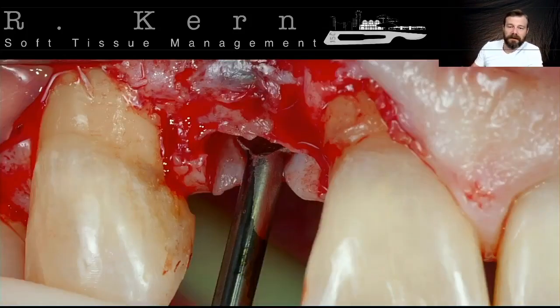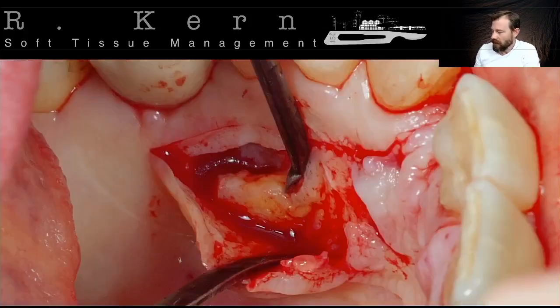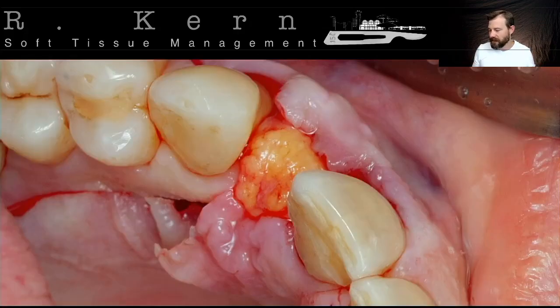And from that point, from the palatal side of that incision that you saw, we're going to detach the pediculum full thickness flap with the periosteum together with the connective tissue. All the thickness that I can bring under the window that I had prepared, right? So here is the full thickness flap. We detach and let the pediculum be loose. After that, I can really bring the pediculum in place, okay?